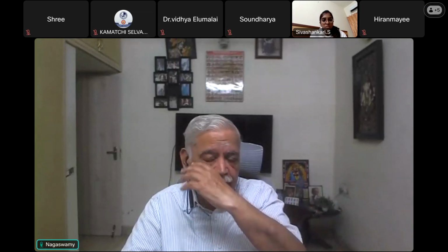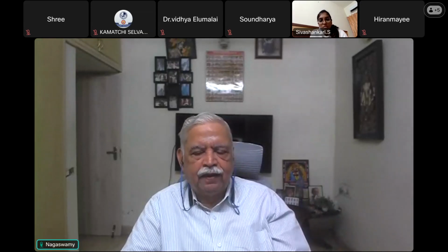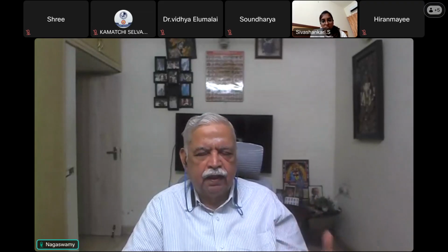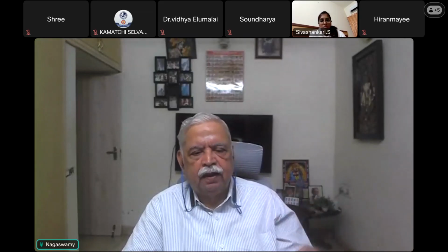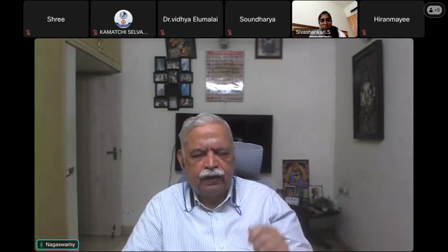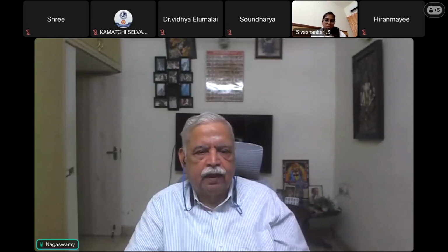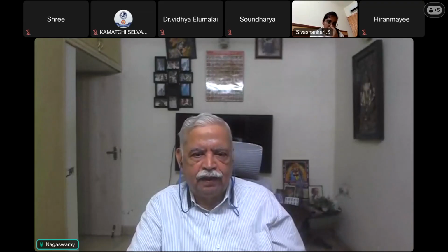So in order to do that, they introduced a mode called synchronized intermittent mandatory ventilation, where the patient has some effort, but it is not sufficient. The muscle power is not good enough to maintain oxygenation and elimination of CO2. So the machine will at that time only assist the ventilation. So the SIMV mode was introduced, and in the SIMV mode, in order to safeguard, supposing the patient after taking 4 breaths becomes apneic again, and the machine is waiting for the patient's breath and not delivering until he starts breathing, there will be a long apneic period, and the patient is likely to desaturate.